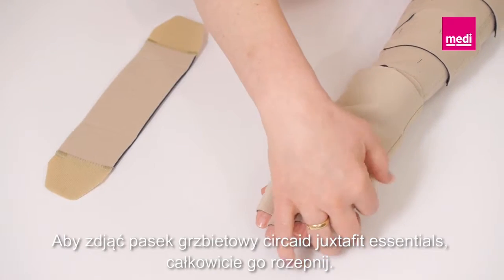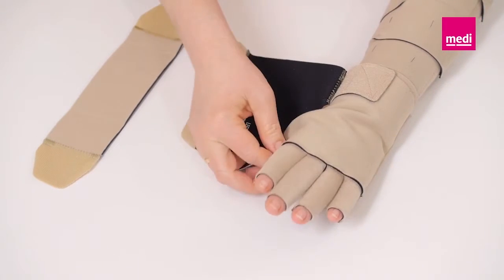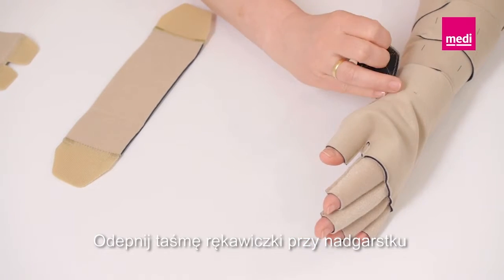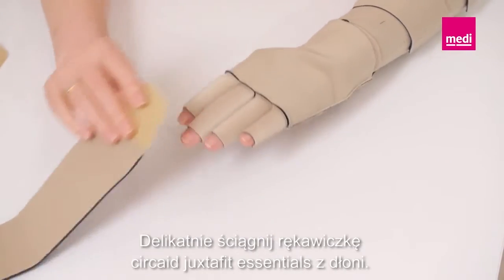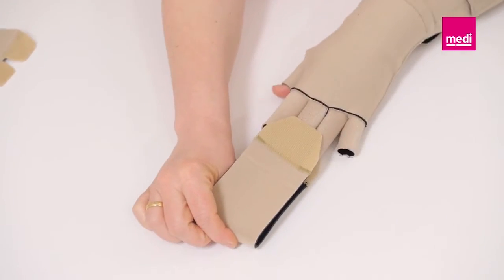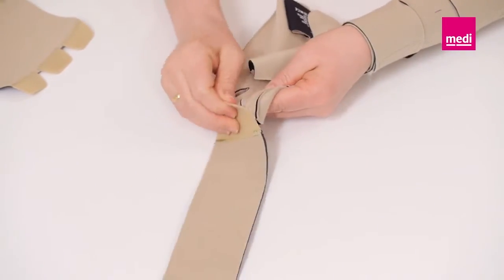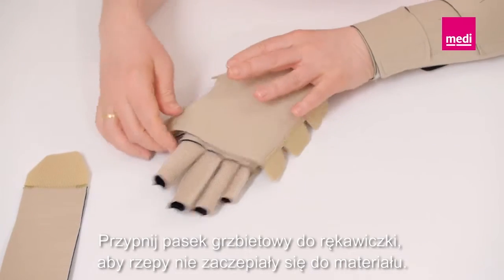To remove the Circade Juxtafit Essentials dorsum strap, detach it completely. Undo the glove's wrist band and attach the removal band to the front and back of the fingers. Gently pull the Circade Juxtafit Essentials glove off the hand. Attach the dorsum strap to the glove to keep the Velcro tabs lint-free.